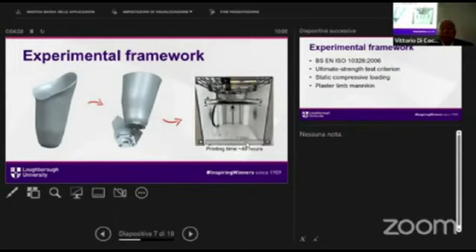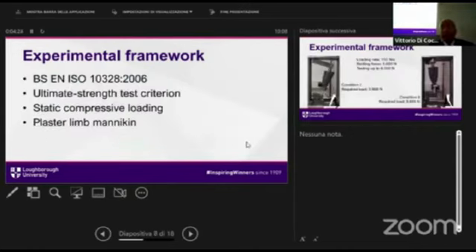So it's generally to demonstrate the entire process. It would take 48 hours on a modern printer to produce one socket, and this is just for a 15-year-old male. And still it is significantly better than doing this in any other way.